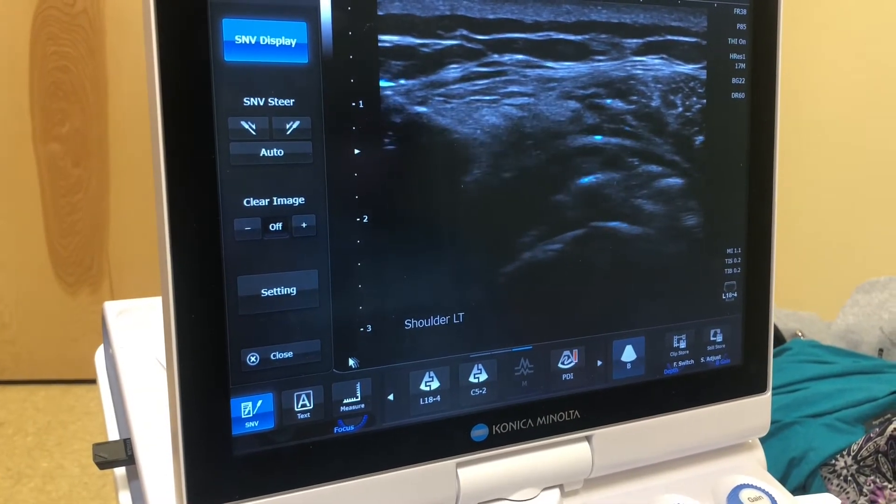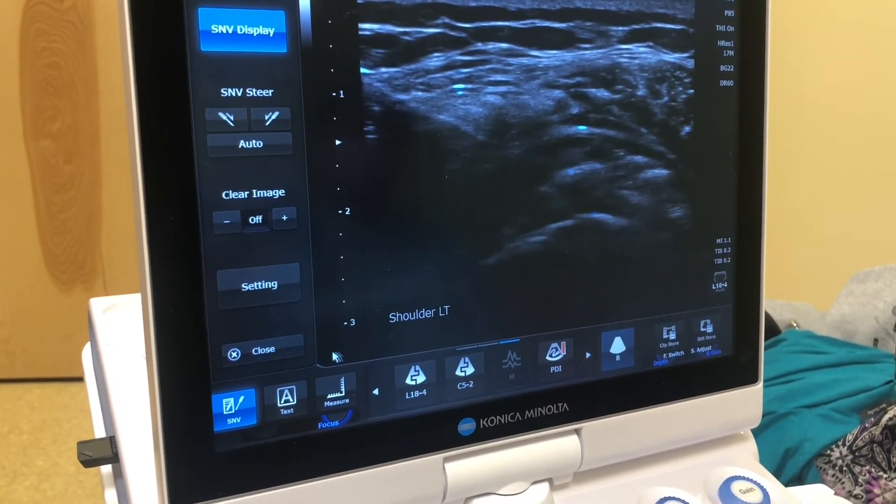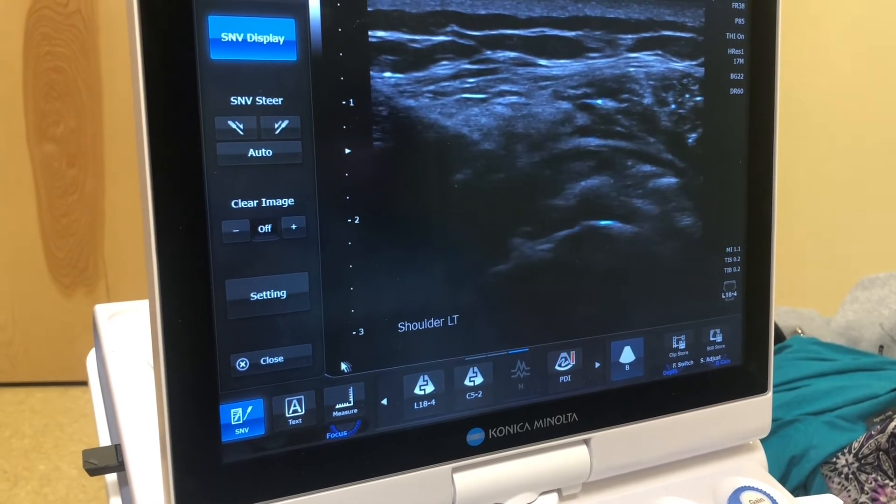Once the lidocaine has kicked in and the patient is numb, which usually takes about 5 to 10 minutes, we can start the rest of the procedure.